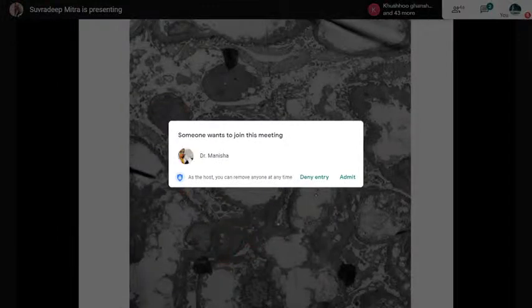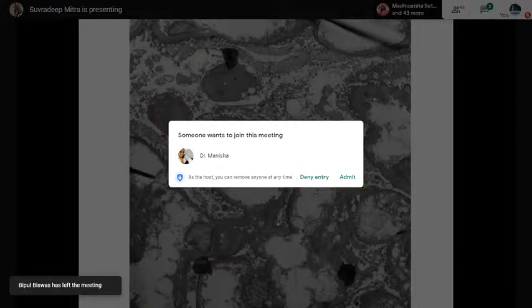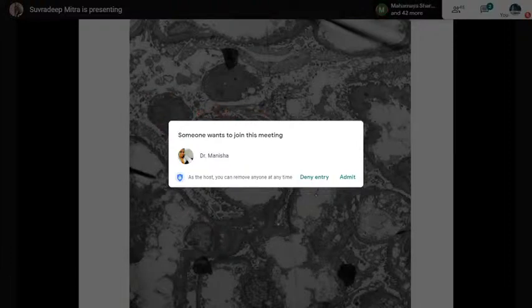Now at the visceral podocyte, you can see only the nucleus, and in the rest of the cell body you can see this kind of fluffy structures. This is the cell body of the visceral podocyte. Now you can see another nucleus of a visceral podocyte just adjacent to this one, and this is the cell body of the visceral podocytes.